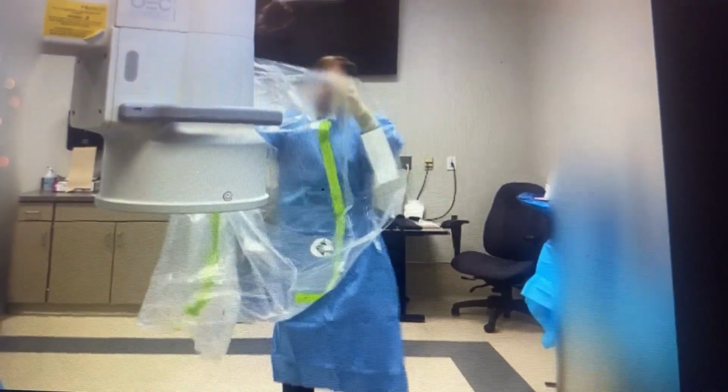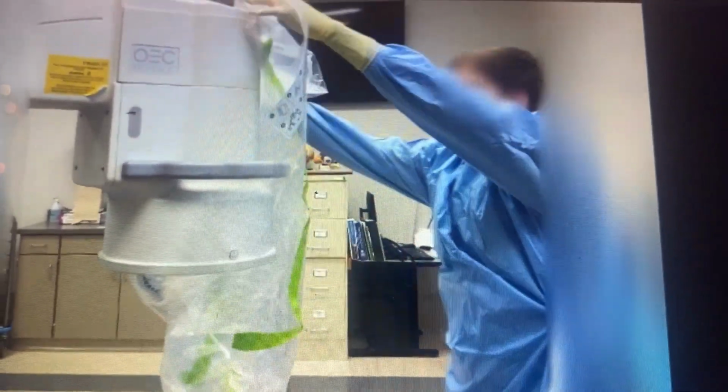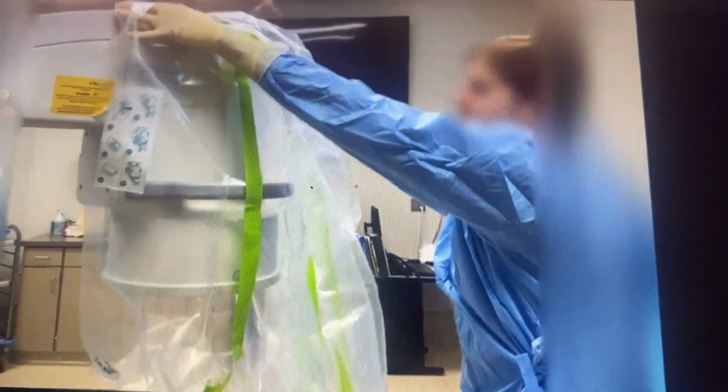They do this because the C-arm is coming close to or into the sterile field, and this drape helps them maintain the field. During this prep time, and always when walking by sterile fields and sterile trays, make sure you face sterile areas. Never turn your back.